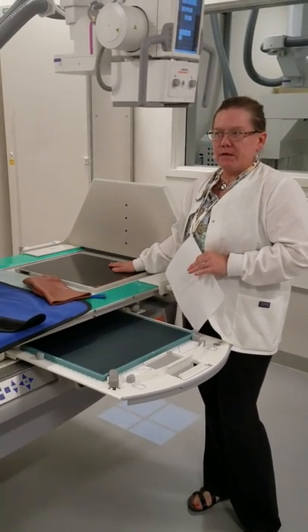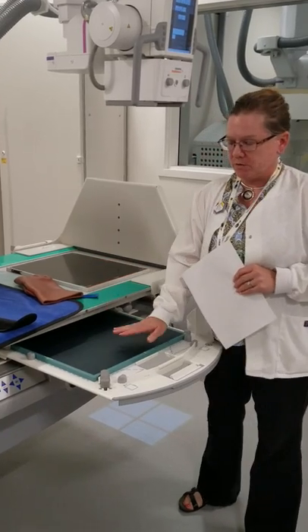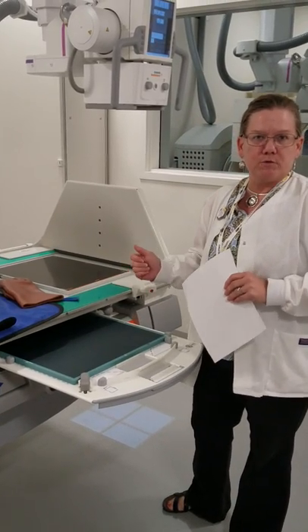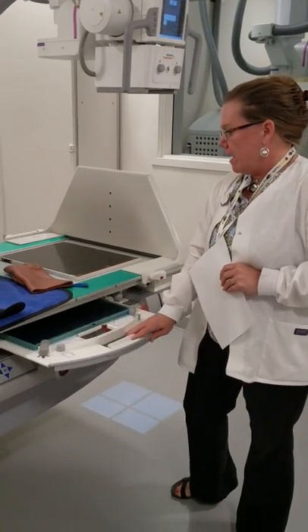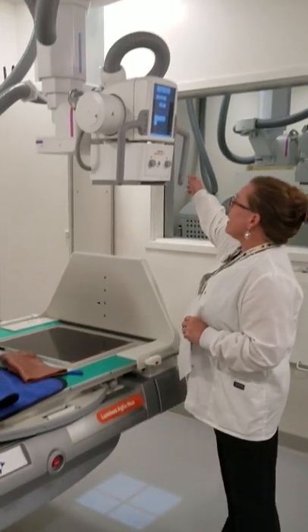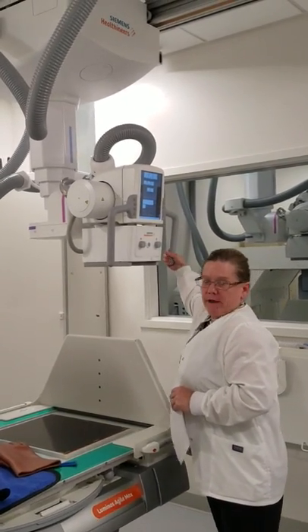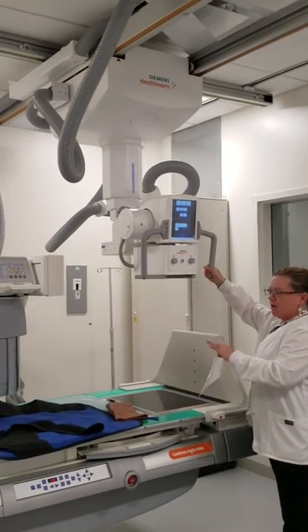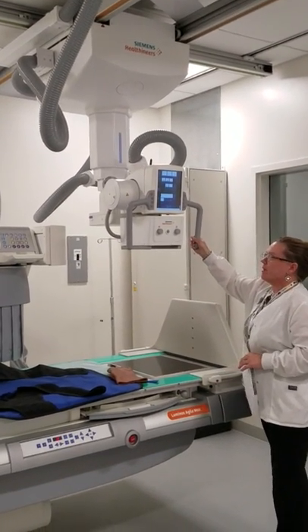With a digital detector, the image automatically comes up on your screen. If we're using a CR cassette, we actually have to run that through a CR reader in the next room. This is the overhead tube — we will bring this over the top of our patient, line it up with our table, and we're ready to take our images.